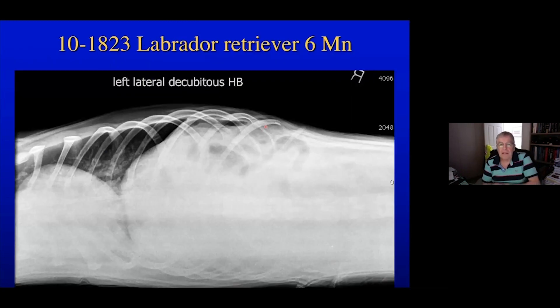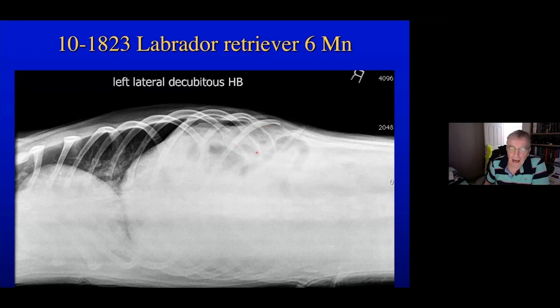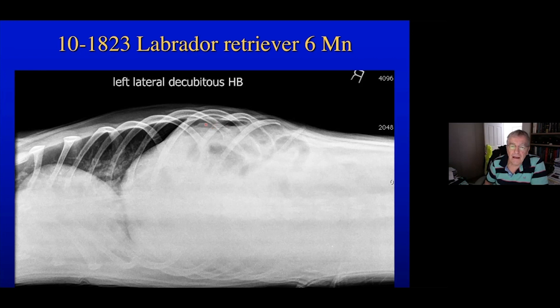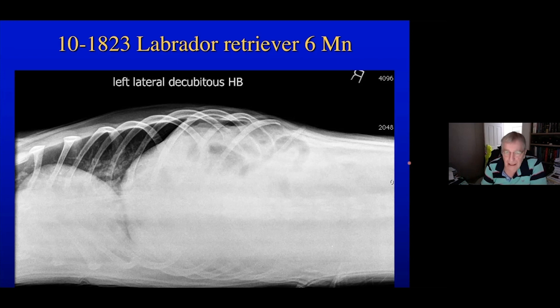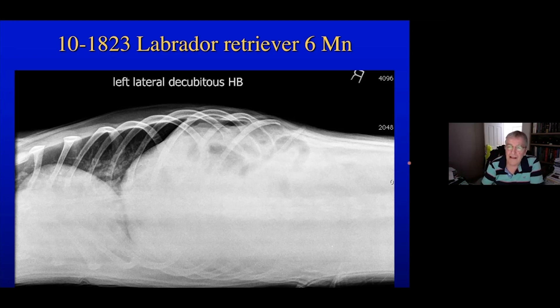We can confirm this by doing a decubitus lateral. When we lie the animal on its left side and leave it for a few moments, free gas within the abdomen percolates upward. We can then see a free gas cap outside the intestines and stomach, underneath the rib cage near the liver — because that's the highest part of the abdomen, where gas rises and abdominal structures fall away from the wall.